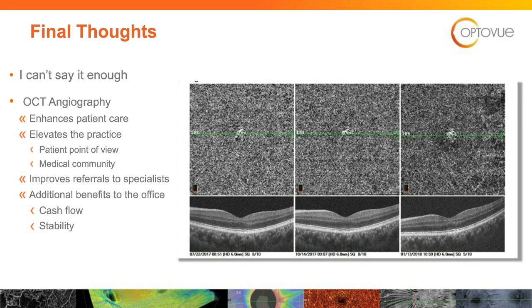Do you use the Optos as a replacement for dilation? And the answer is no here. We dilate every single patient that we have. And I'll even add to the question: we do not use wide field OCT to replace dilation. We don't use Optos to replace dilation. We dilate most patients. Sometimes they come in and they've had a dilation last year. They haven't had any symptoms, so we don't have to dilate every year. But it does not replace dilation.